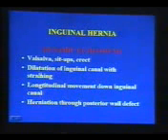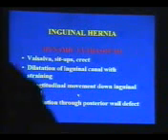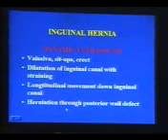For inguinal hernia, dynamic ultrasound is very important. We use Valsalva or sit-ups or erect. We scan the patient in 3 postures. Dilatation of the inguinal canal with straining is seen. Longitudinal movement down the inguinal canal is important, and herniation through a posterior wall defect is seen.